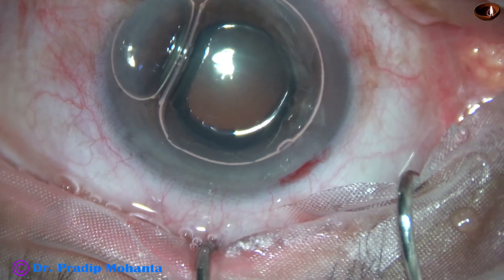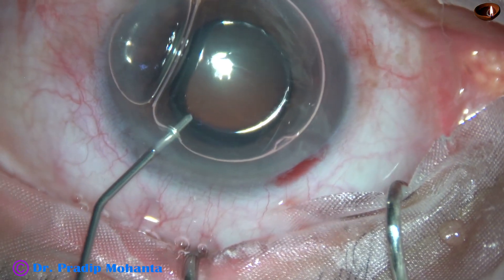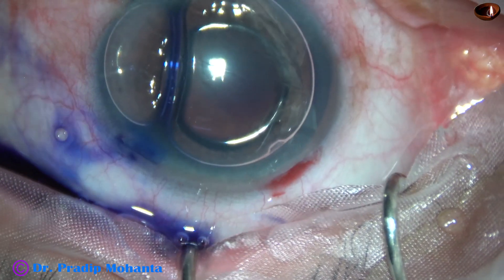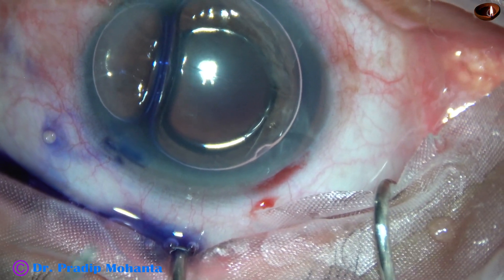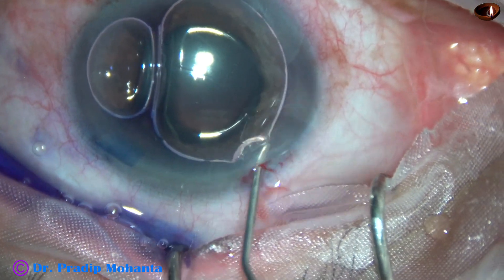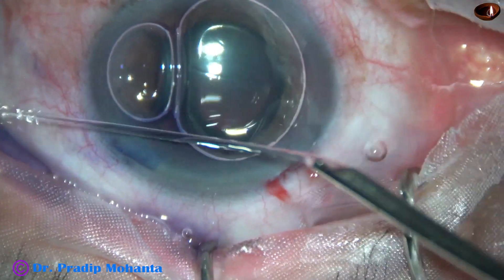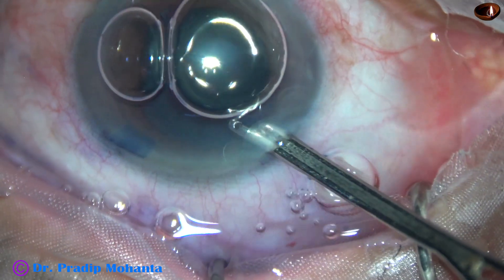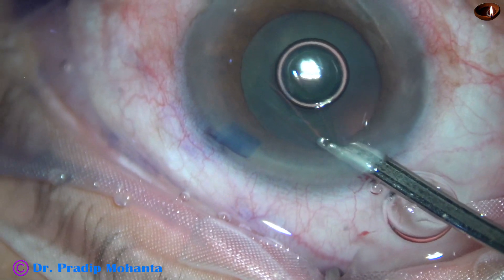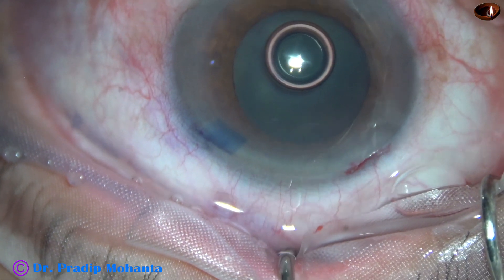My plan is to stain the anterior capsule with trypan blue dye underneath this air bubble. If we use an air bubble, staining is quick. This is a bit of adrenaline. Let us see if the pupil dilates a little more with adrenaline. As I wash the dye out, I find that yes, the pupil has dilated a little more with the help of the adrenaline.